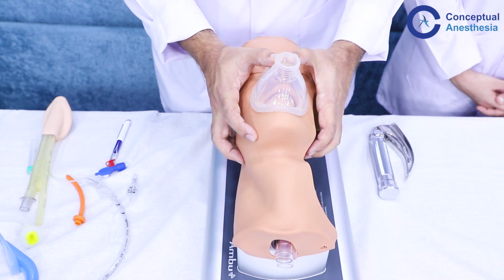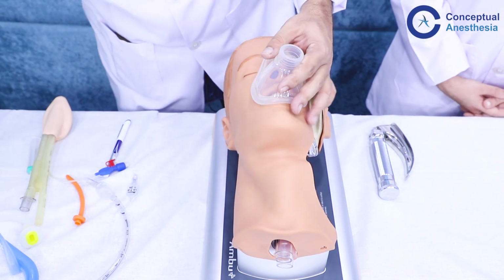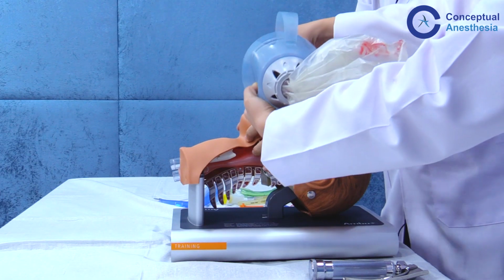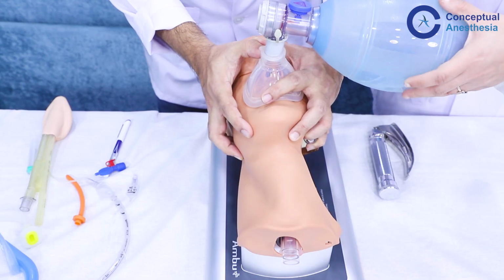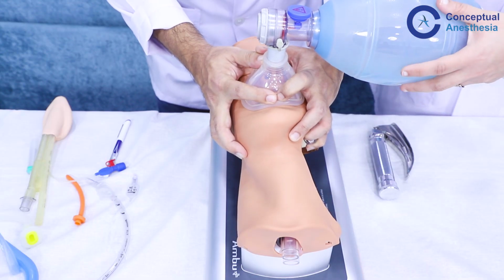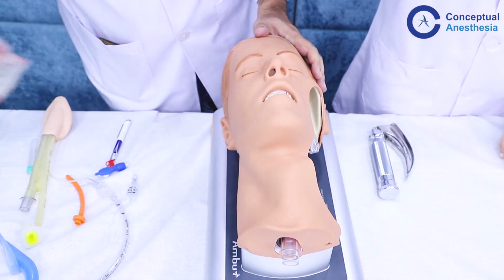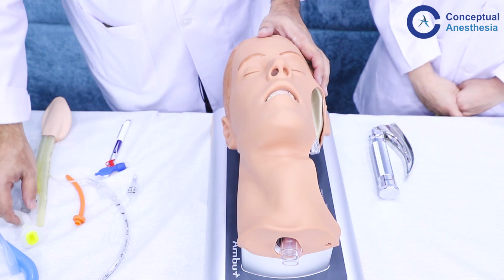If this is also not possible, we use a 2-person technique in which the mask is held by one person and the ventilation is done by the other person. So this will give one person the liberty to put all his strength onto holding the mask properly. Now, if mask ventilation is initially not possible, we can use adjuncts like oropharyngeal and nasopharyngeal airway.